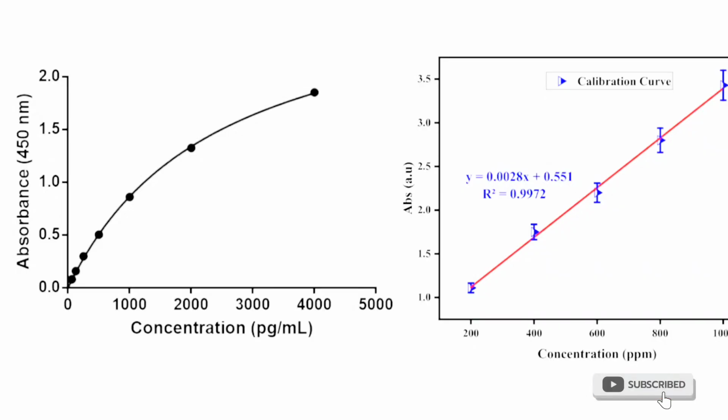And that concentration, we are not talking about whether it is abnormally high, abnormally low or normal. No. At this point, we are talking about whether the result we are getting is consistent with the analyte, with what is in the sample, and consistent with the patient. Does that make sense? So even if the result is high, for the fact that it is consistent with the patient, that is fine. Does that make sense? So if you get an absorbance of, let's say, 3.5, that is high, obviously, but the result it is going to give you, even though it is high, is what is consistent with that very patient.